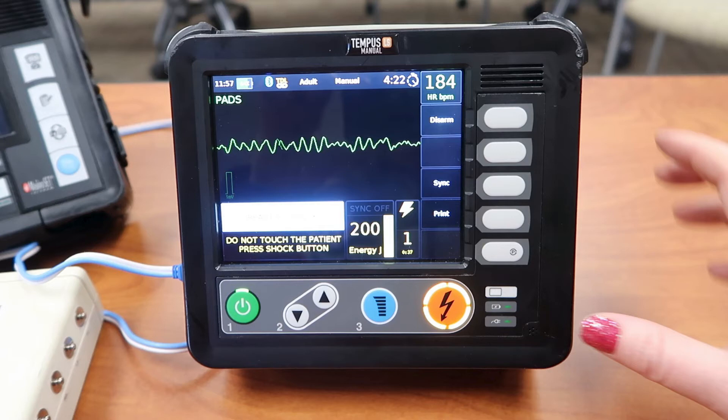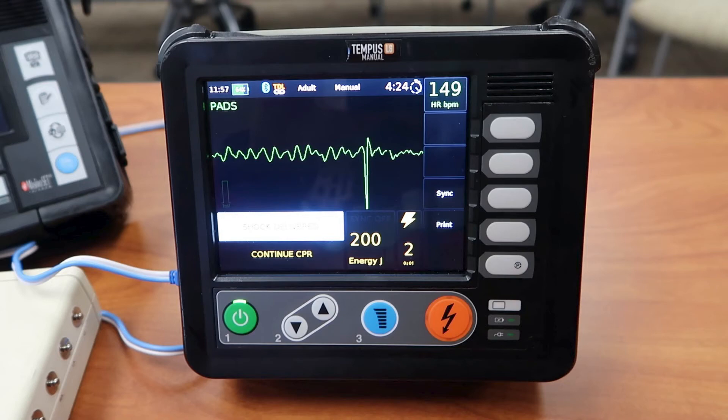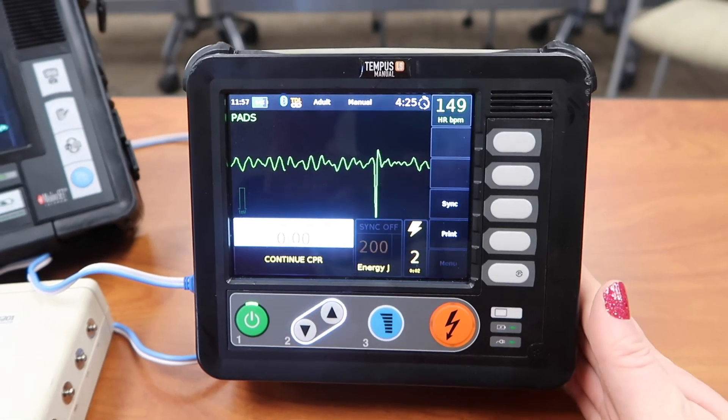Make sure your team is clear. Make sure nobody's touching the patient, and go ahead and press that orange button. You don't have to hold it down like you do whenever you're cardioverting a patient — it's just a quick press. You'll notice that the message right after you press the shock button is 'continue CPR,' so you'll continue CPR.